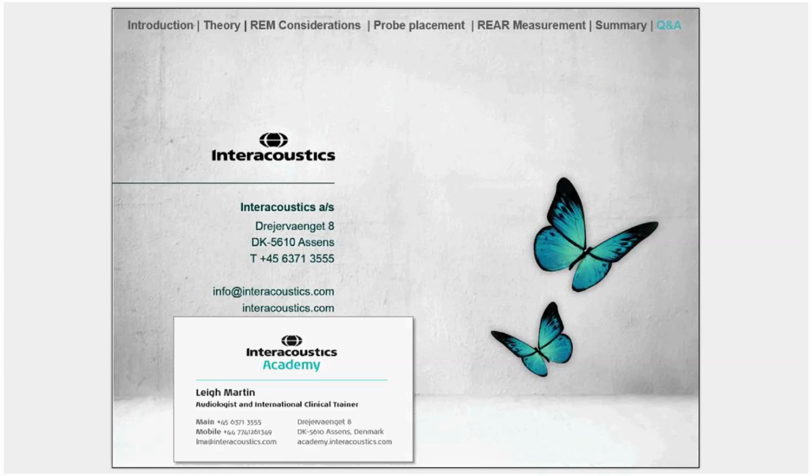Now, what you can actually then do is look at the real ear occluded gain, and if you see the line to be sort of flat or dipping in the minus values, then that's going to tell you that the hearing aid is not a true open fitting, and it's blocking the ear, and that could cause the patient to be suffering from the occlusion effect, and then they'd be hearing their own voice more.